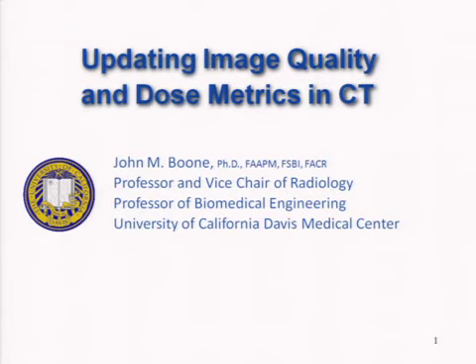The issue of if you've already had 50 millisieverts, should you have another CT scan? Obviously, that depends on why that CT scan is ordered. And so we've heard a lot in the press and the New York Times and all that about the risk of CT and other radiation procedures. But what we're trying to move to is a benefit-risk discussion, because if that patient needs that scan for surgical planning or to see if they have a broken whatever, obviously that probably will outweigh the associated risk. So it's a more complicated question that's not able to be answered in a few minutes here, but I think you know where it's all heading.